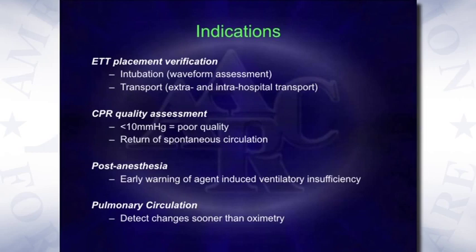Also, if we see a marked increase in the CO2 concentration as we're doing compressions, it can be associated with return of spontaneous circulation and is an important metric to help us assess whether or not the patients are responding to the treatment.